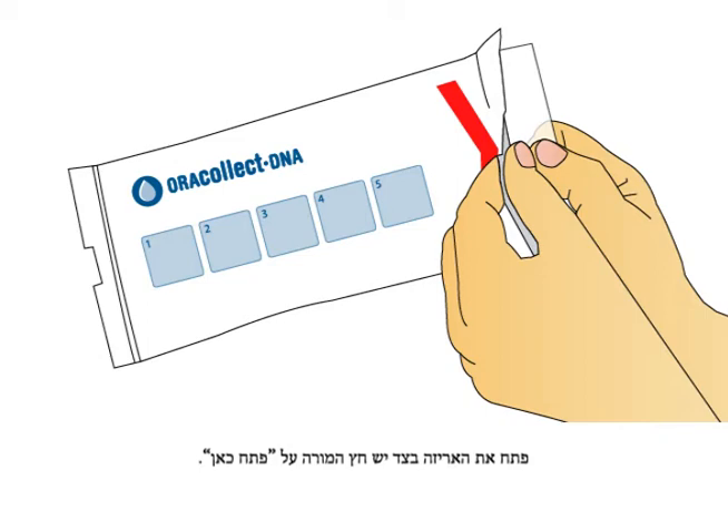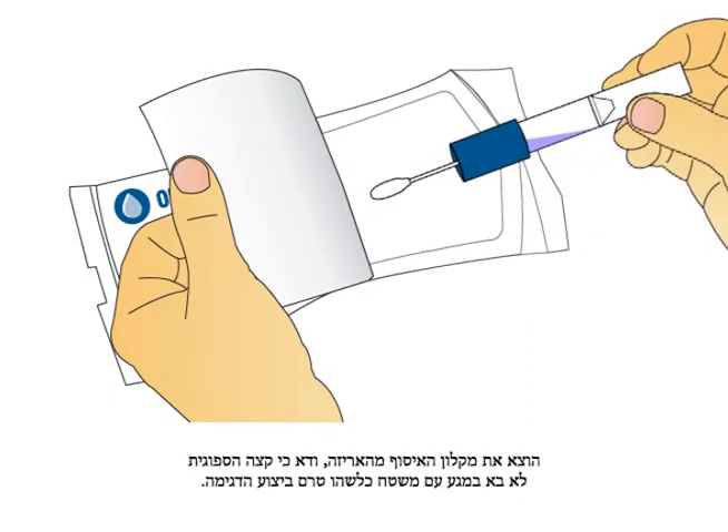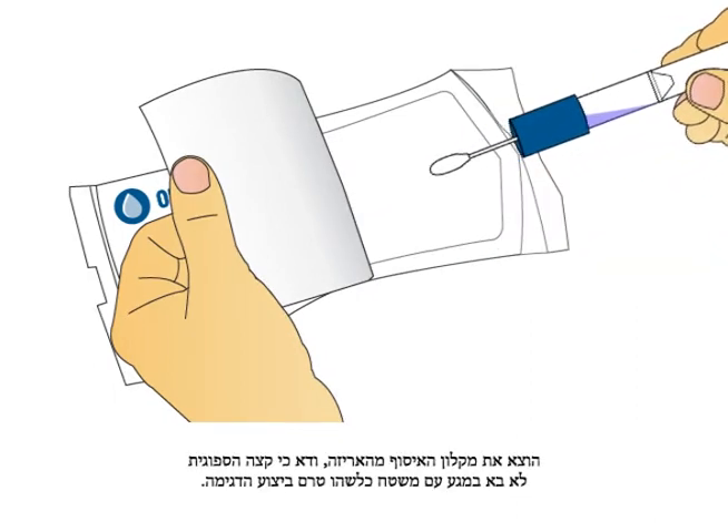Open package from the end with the open here arrow. Remove collector by its handle from the packaging. Ensure the sponge tip does not come into contact with any surface prior to collection.